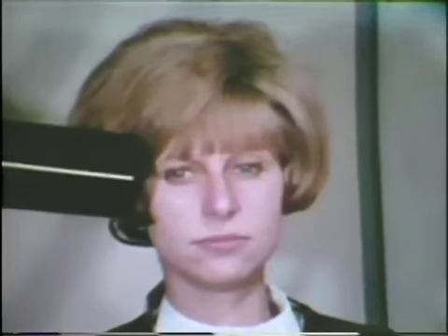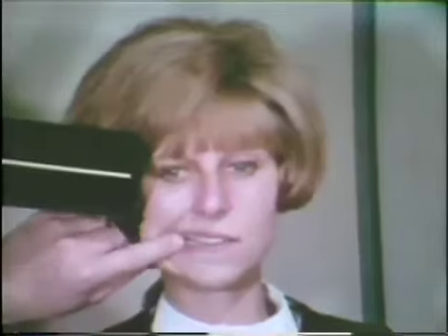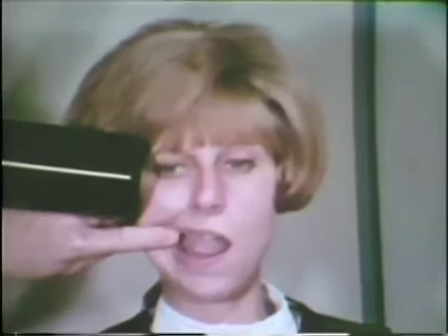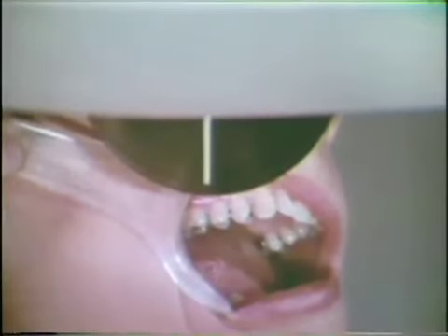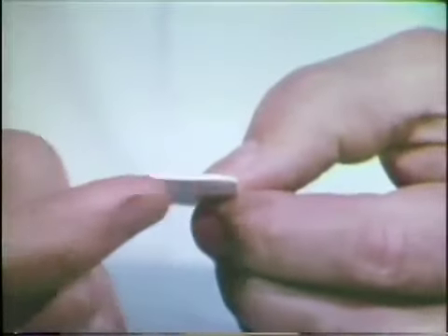Returning now to our procedure, the vertical angulation of the X-ray head is set at 8 degrees downward. Our patient has remained in her proper position, and we move the X-ray head into an elevated temporary position to allow proper horizontal alignment of the X-ray cone. The central X-ray beam should be directed through the interproximal space between the upper second bicuspid and molar, and aligned parallel to the cusp tip line of the bicuspid. We are now ready to insert the film.